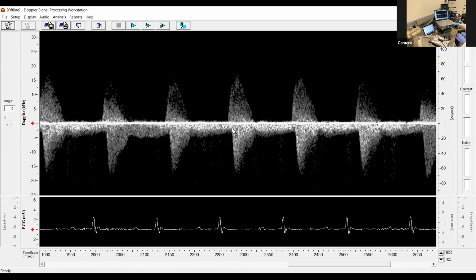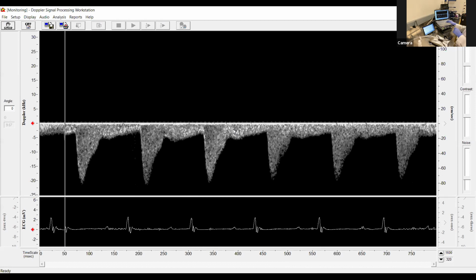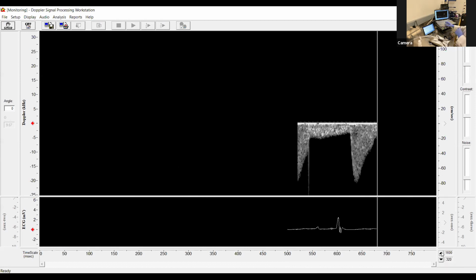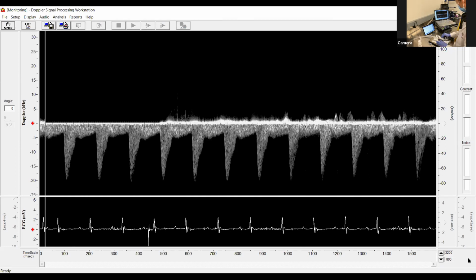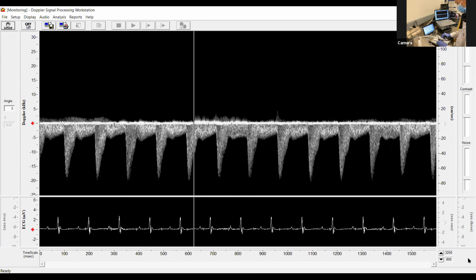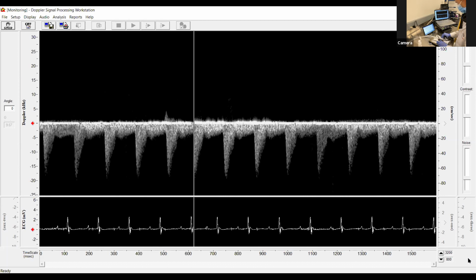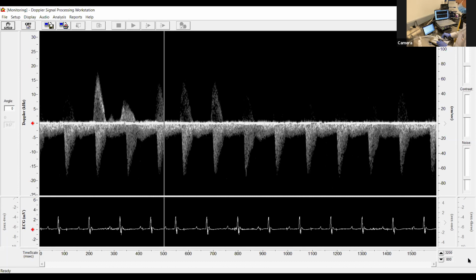If anyone has questions, please feel free to put them in the Q&A dialog box. Sure. Yep, okay, so we'll try this one again to get a stronger outflow signal coming from that top. So when you change the scale and time too far, it's a little crazy. Okay, so again, if anyone on the demo has questions, please put them into the Q&A dialog box and I'll work through them with Sydney as we go.